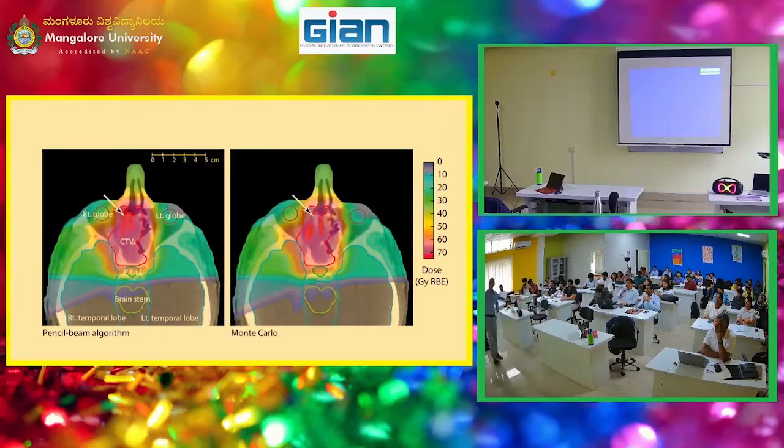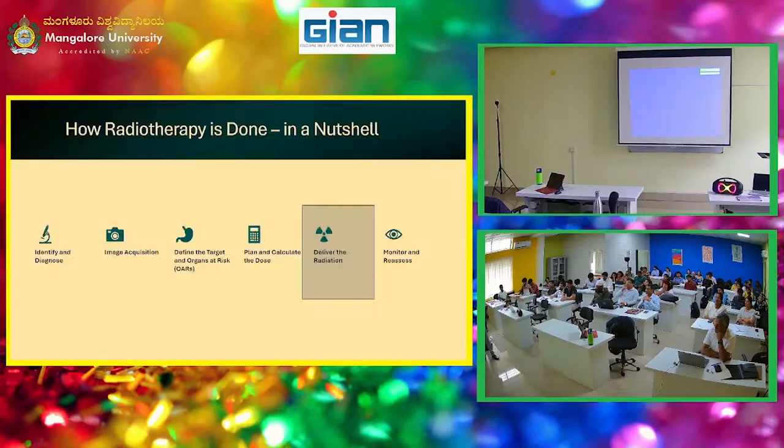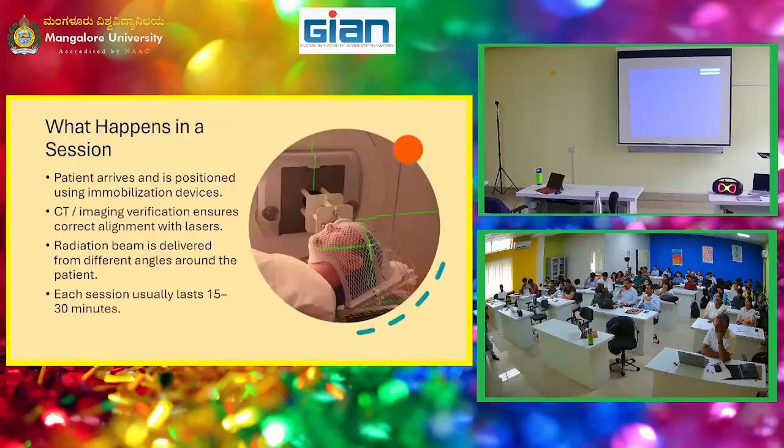And that's one of the target areas that we're working with. So when you deliver the radiation, we've basically gone through all this, but what I wanted to point out is it's 15 to 30 minutes. You also have to realize how long a patient can lie still for. MRI is brutal. If you haven't gone through an MRI, you have to lie there for so long, and it's annoying, but you do. So 15 to 30 minutes is actually pretty good for patients to stay.